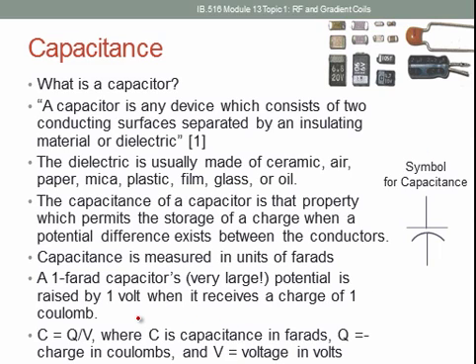The unit of capacitance is the farad. The way these are designed, a 1 farad capacitor would be very physically large. So capacitors are usually in the picofarad range, where pico is 10 to the minus 12.